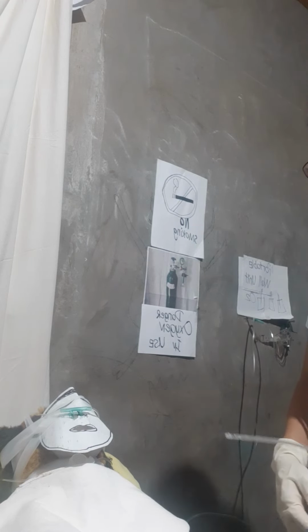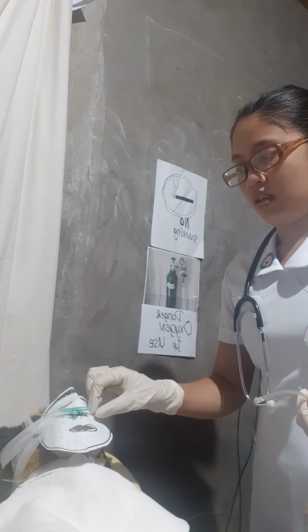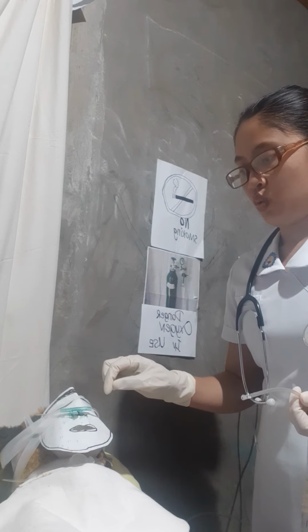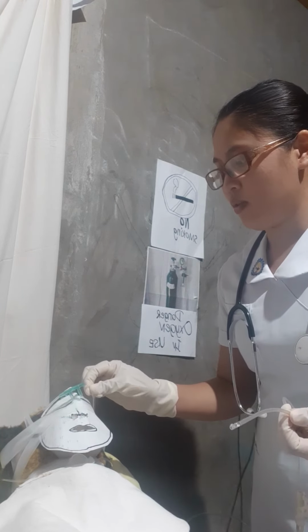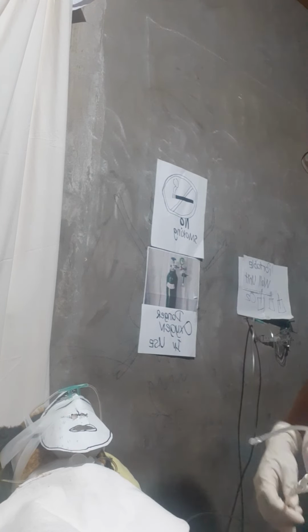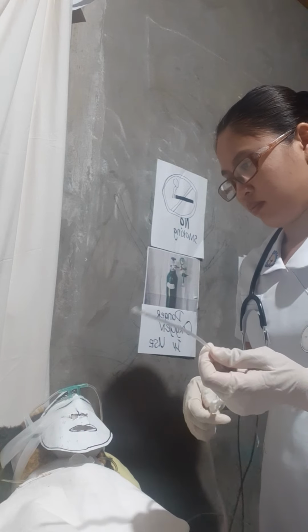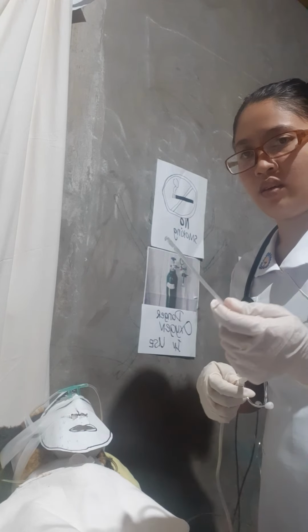Next, using the non-dominant hand, remove the oxygen device. Excuse me, sir, I will just remove this one so that we can begin the suctioning. And then hold the catheter between the forefinger and the thumb.